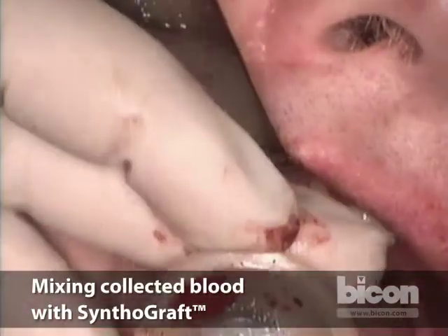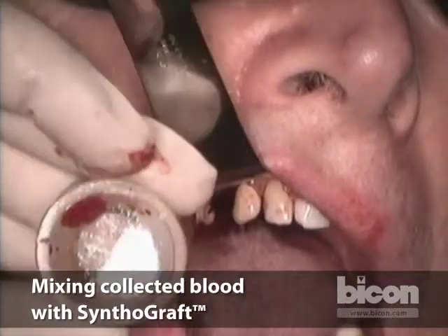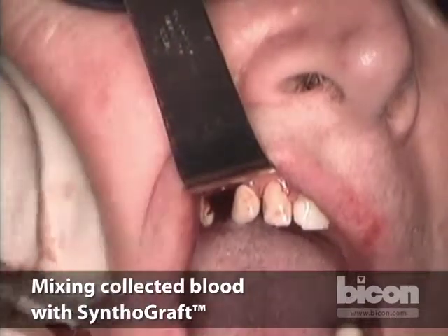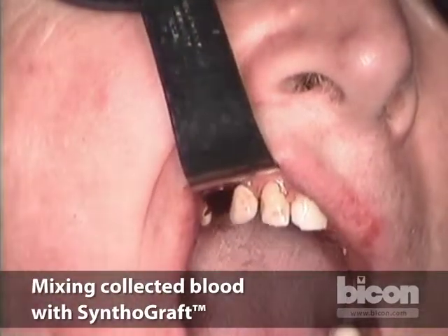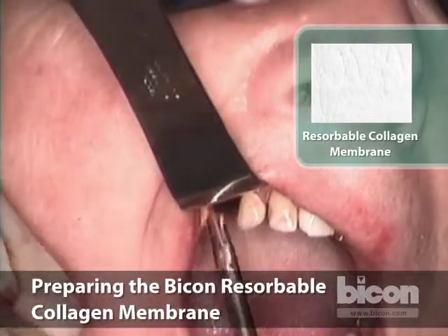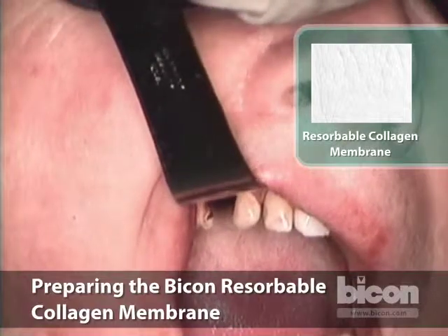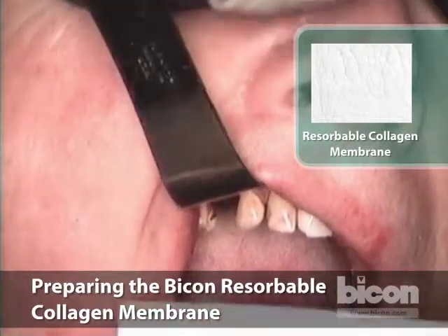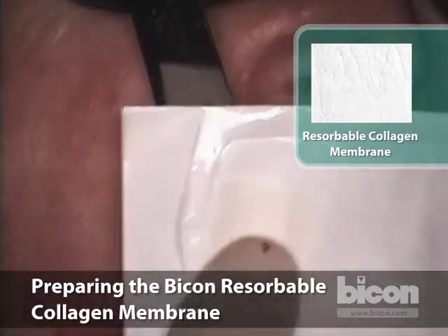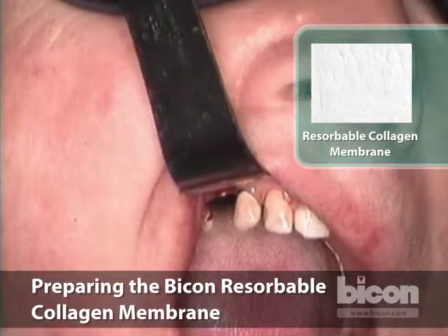The autogenous bone kept off to one side. The bone graft, it's the white particles in the bottom of our silicone dappen dish. We will use some of the blood that we had collected and saved. We will now mix it. The next step to do is to take a little paper template, which is the wrapping of the resorbable membrane. As you see, it comes in this wrapping, so we will peel it, take the membrane out and secure it.